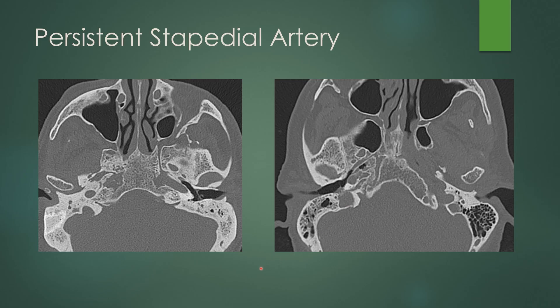A persistent stapedial artery is harder to diagnose because it's difficult to see the stapedial artery. When looking at a temporal bone CT for pulsatile tinnitus, always look for the presence of foramen spinosum. Here's foramen ovale, which is anteromedial, and here is foramen spinosum, which is posterolateral at the skull base — the opening for the middle meningeal artery. Absence of the middle meningeal artery leads to a persistent stapedial artery to supply the intracranial dura. If foramen spinosum is absent, that can be an indication of a persistent stapedial artery, whether you can see it or not.